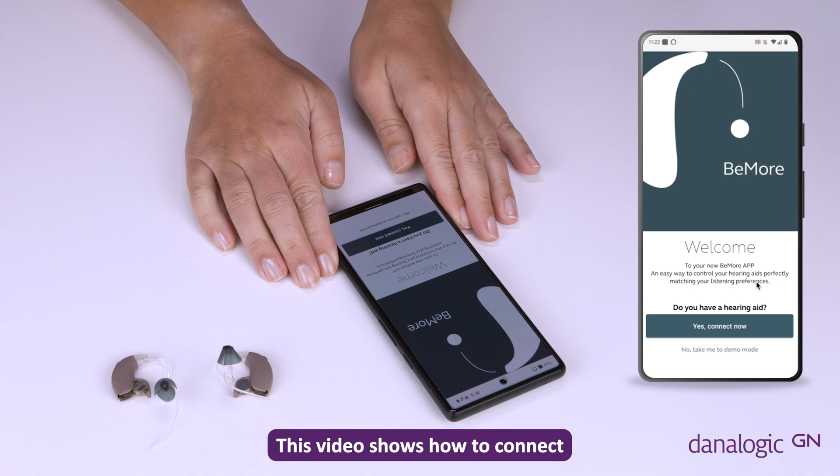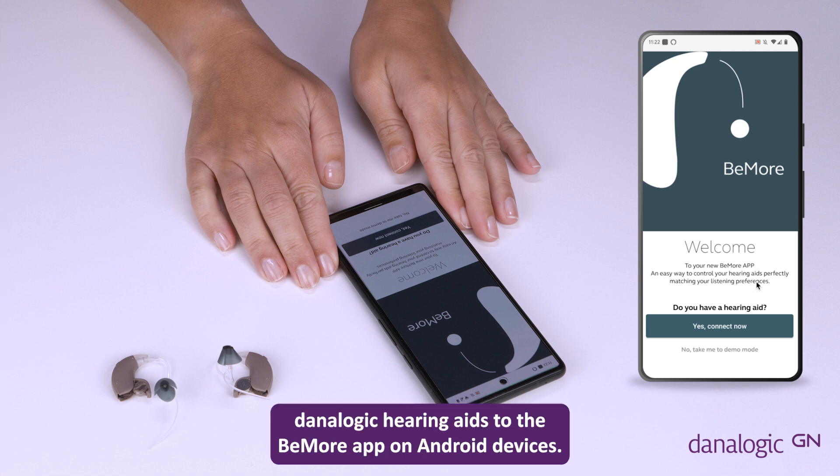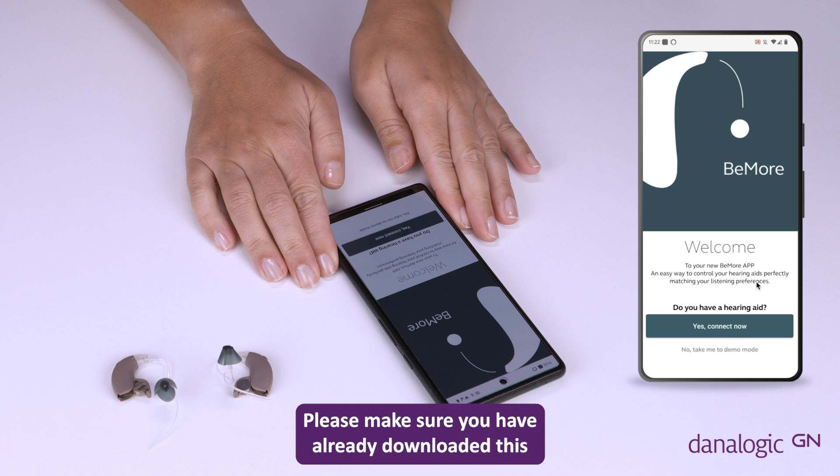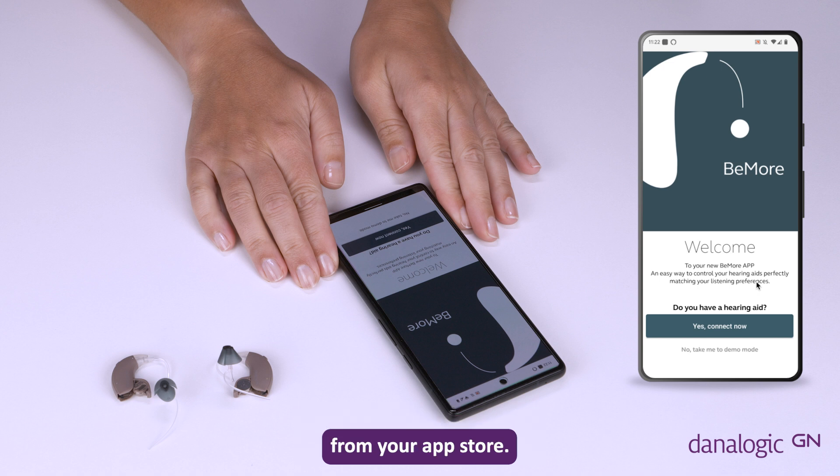This video shows how to connect danalogic hearing aids to the BeMore app on Android devices. When connecting an Android device, you will need to pair the hearing aids to the device via the BeMore app. Please make sure you have already downloaded this from your app store.